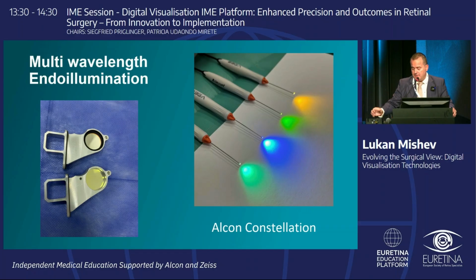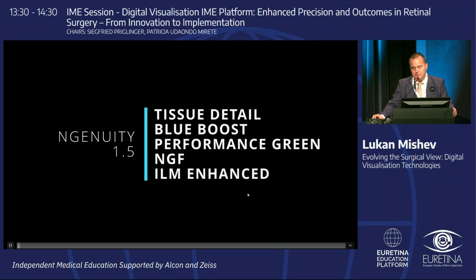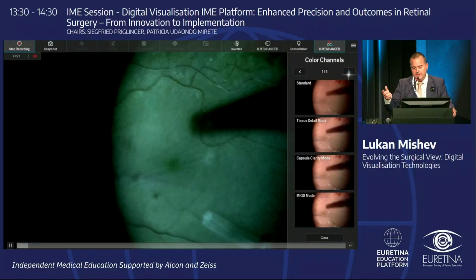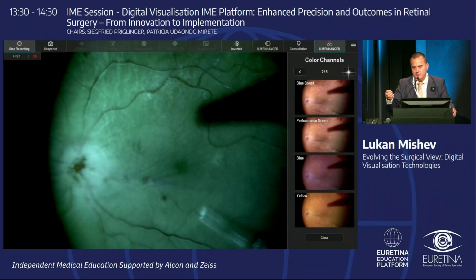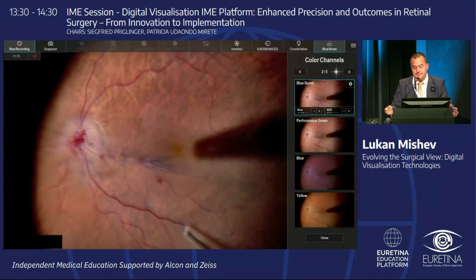And you might be amazed that actually the yellow color is the one that is most reflected. So if we change the color of the illumination and we apply a dedicated filter to that color, we might extract more imaging data from the area that we want to observe.